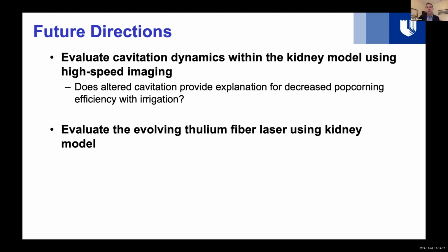Moving forward, we hope to evaluate cavitation dynamics within the kidney model using high-speed imaging, which may provide insight regarding decreased popcorning efficiency with irrigation. And last, with increasing thulium fiber laser lithotripsy, we plan to evaluate thermal safety and efficiency in this even less well understood space.